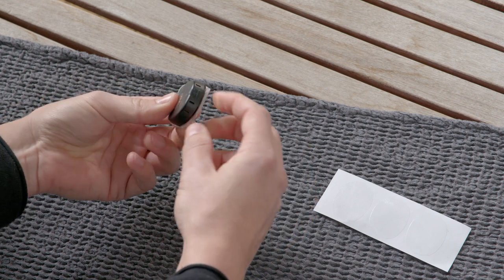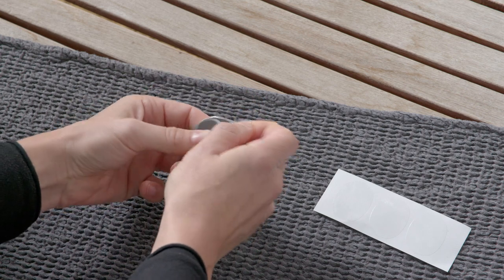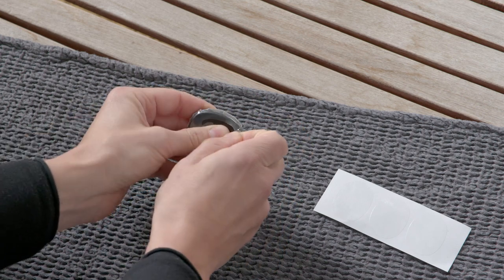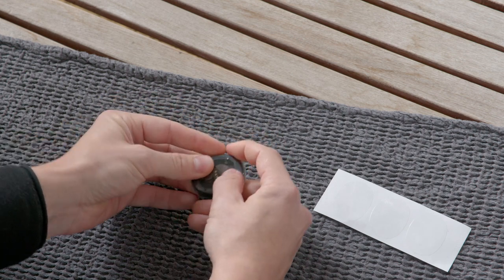Hold RONDO3 between two fingers and grab the circular-shaped flap with your other hand. Pull waterware over the entire processor. Make sure the cover fits snugly around the processor without any wrinkles or air bubbles.